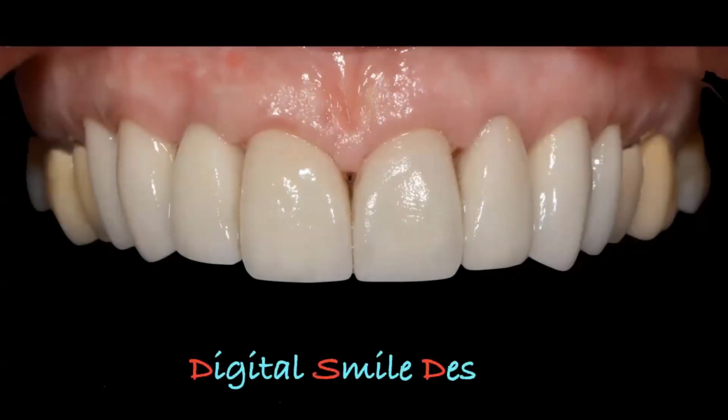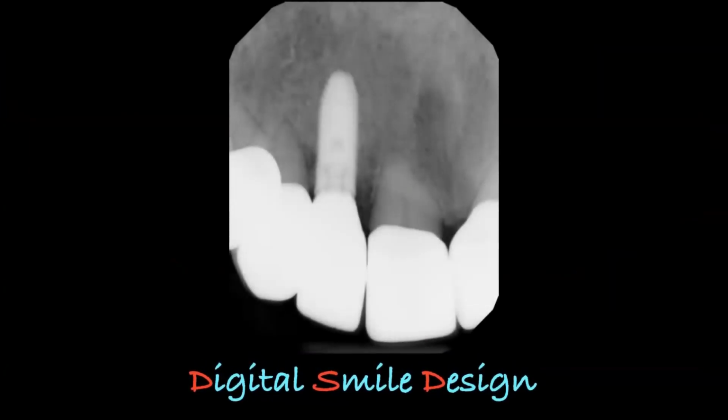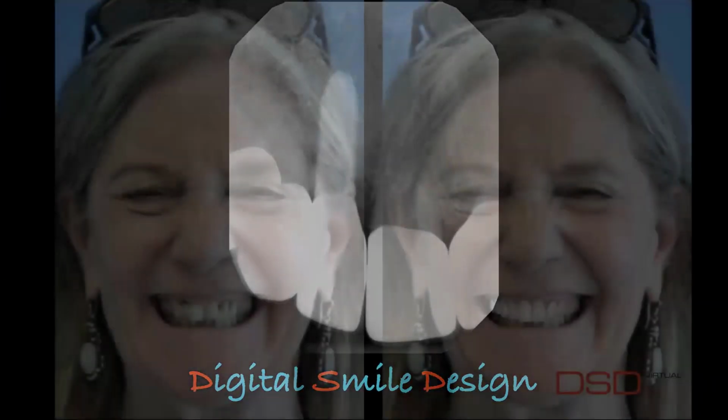Now, we didn't do the whole mouth. We only did up to the first premolar on each side. We didn't do any grafting. We didn't do anything. We kept the implant where it was. And so you can imagine, by communicating to the patient what we're doing and saying, hey, listen, this is your mouth, this is your smile, this is what you're doing. Can we provide you with something that's also going to be pretty reactive and pretty happy?